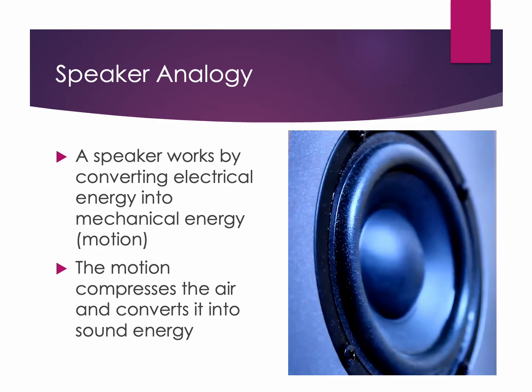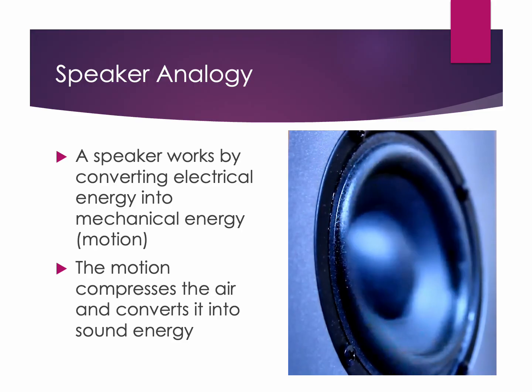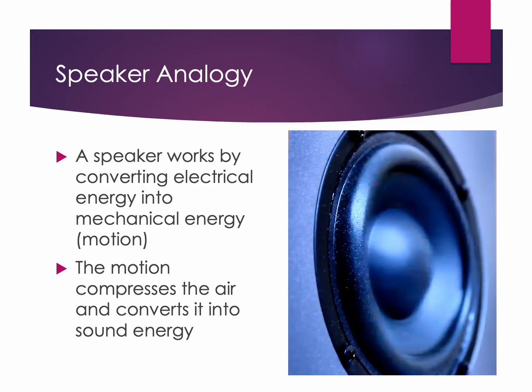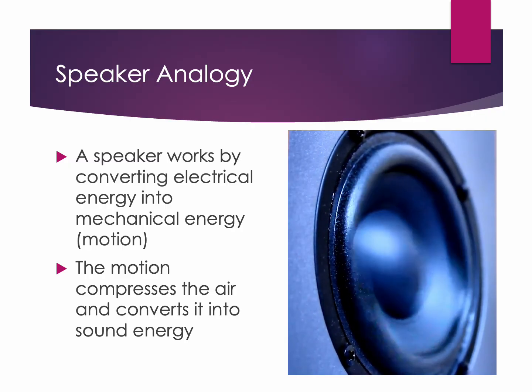A potentially helpful way to think about this is like a speaker. A speaker converts electrical energy into mechanical motion, which then creates sound waves by compressing the air. Ultrasound works similarly, except instead of producing audible sound, it produces high frequency waves used therapeutically.